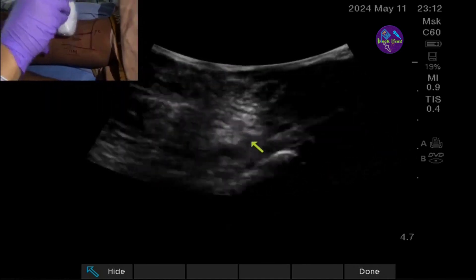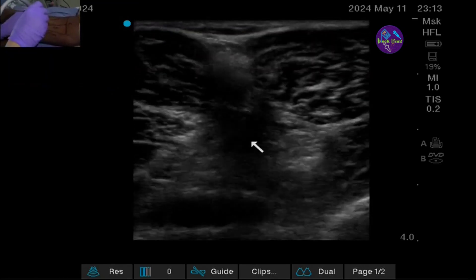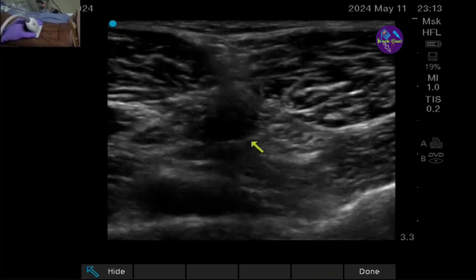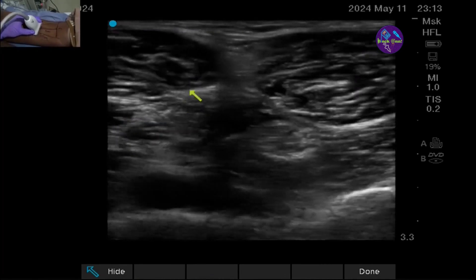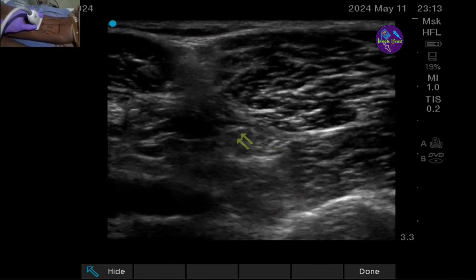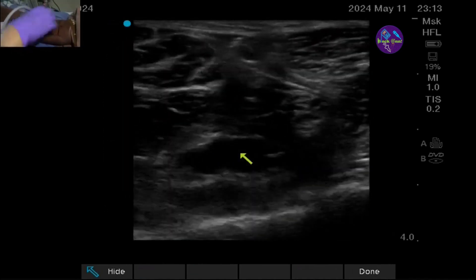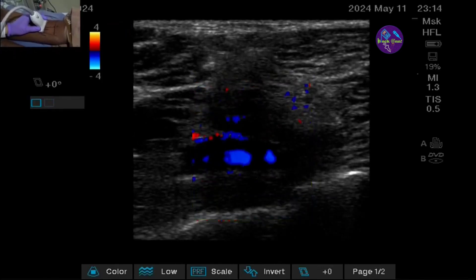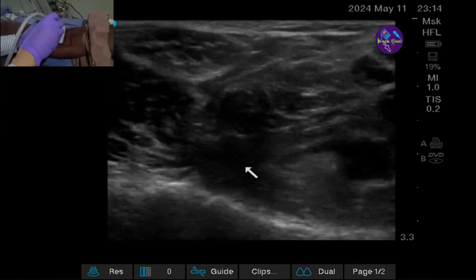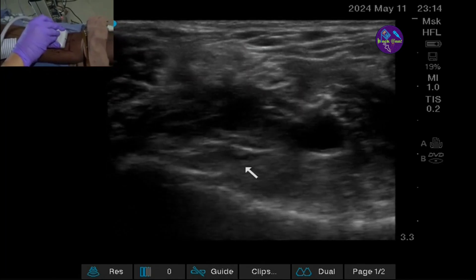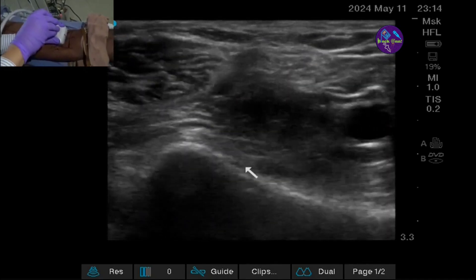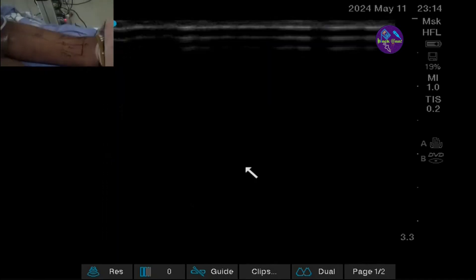We have reached approximately seven to ten centimeters above the popliteal crease. Indicator towards me — medial side shows semi-tendinosus and semi-membranosus, lateral side shows biceps femoris. Here is your sciatic nerve, and you need to find the popliteal vessels. Scanning just above the popliteal crease, you can see the nerve dividing or diverging. At this point you can perform the popliteal fossa block, approaching in between the two divisions.